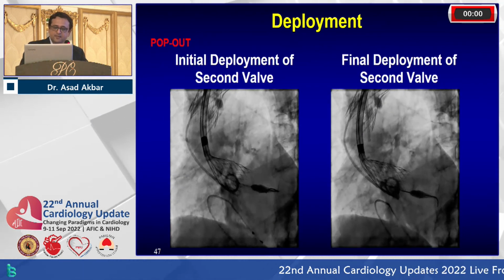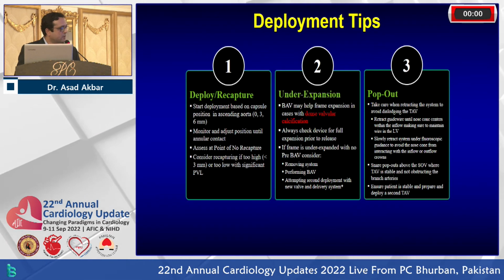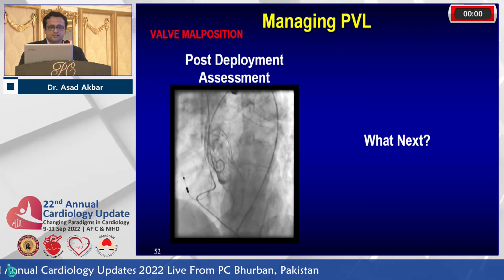So this is a valve being deployed, and the deployment was pretty good. Again, we have to make sure we are deploying under fluoro, making sure we are following all the rules, and then managing PVL.